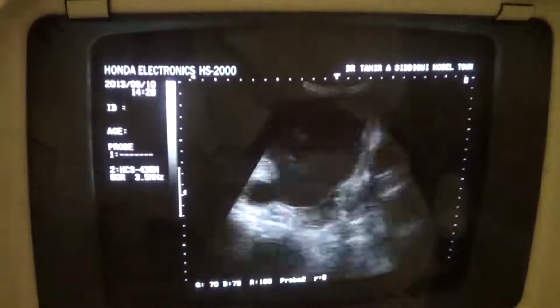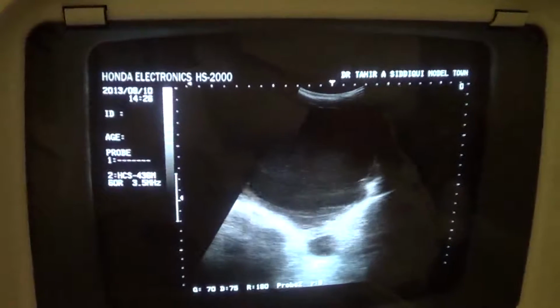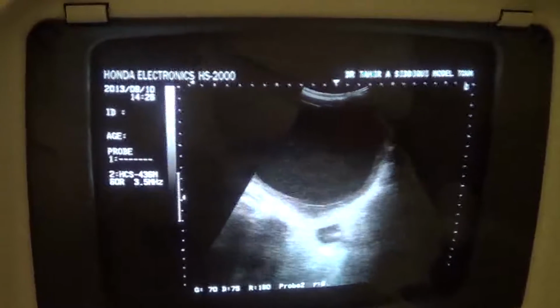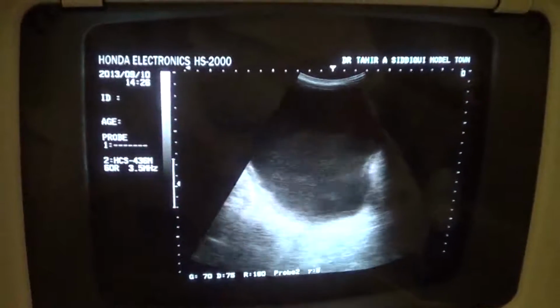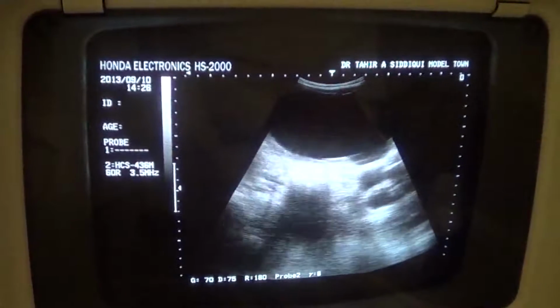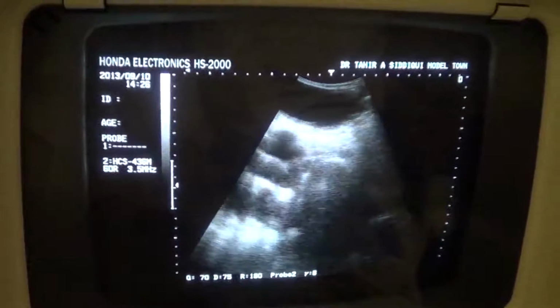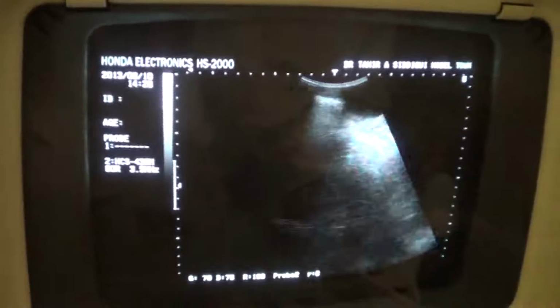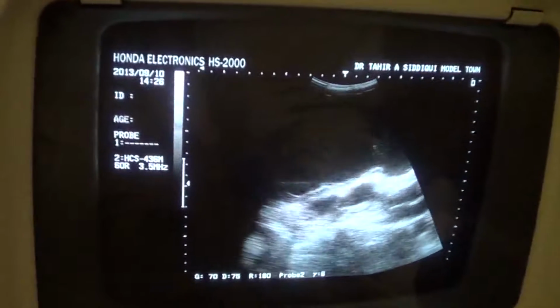I'll have to ask the patient to go. Now what you are seeing is in fact a distended urinary bladder. This is not a pelvis. This is not renal pelvis. I was intentionally saying that this is the pelvis, so that if something comes to your mind, that both pelvises are dilated, where are they separated, and I have shown you the pelvis initially.